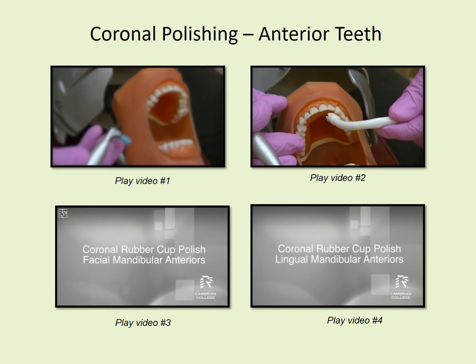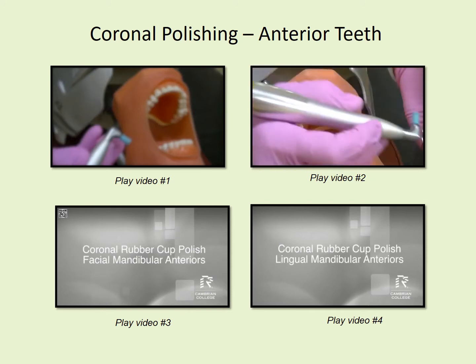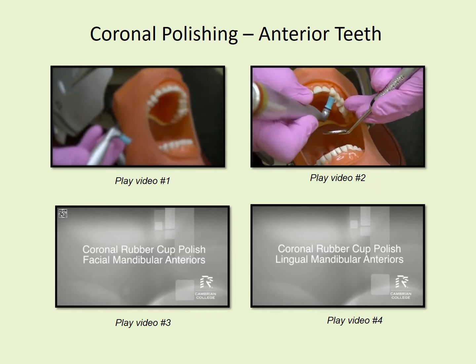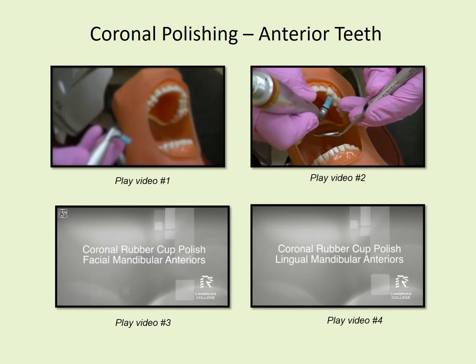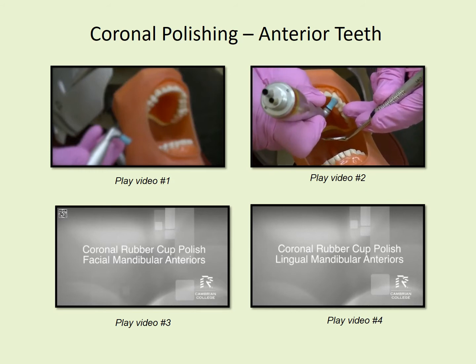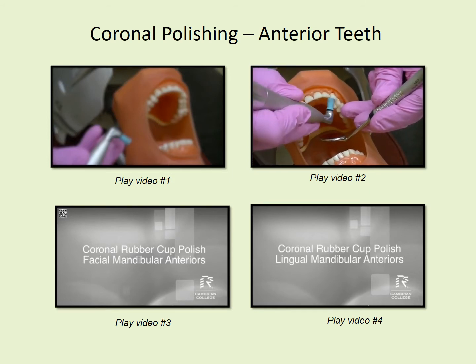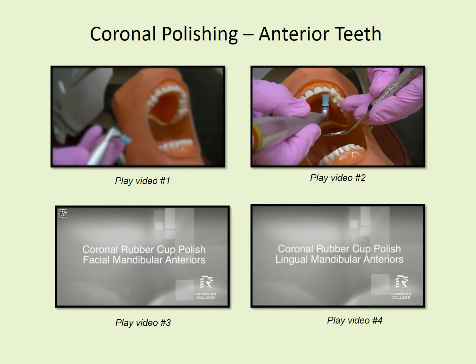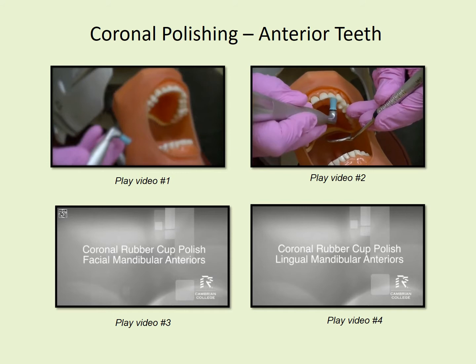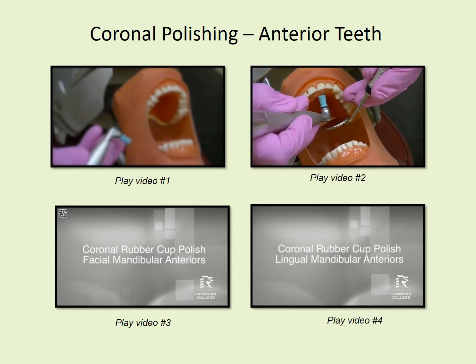Okay, the lingual of the max anteriors. This is the area you'll be at 11 o'clock and using indirect vision. So we'll start on the 2-3 and have the client's head towards you slightly so that you can start, and again looking indirect vision, and work towards your fulcrum. You're fulcruming right directly on the incisal edge of the max anteriors.